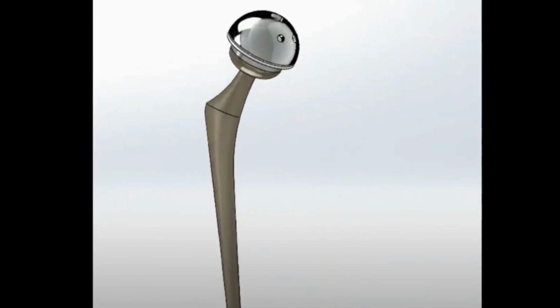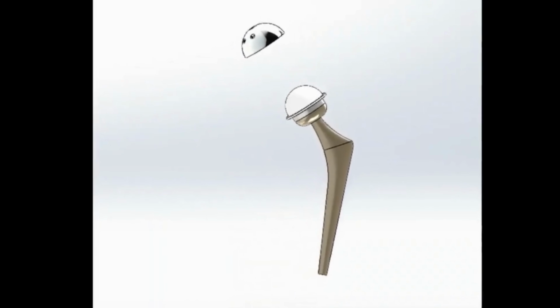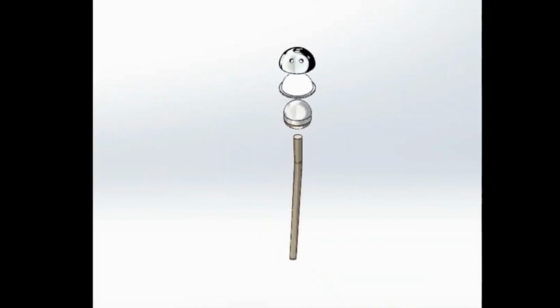After precise manufacturing of each component, the hip replacement procedure can begin. The femoral stem, femoral head, plastic liner, and acetabular cup are cleaned to prevent any infection. Even though there are only 4 components, each plays a crucial role in assembly to return the patient's hip function.